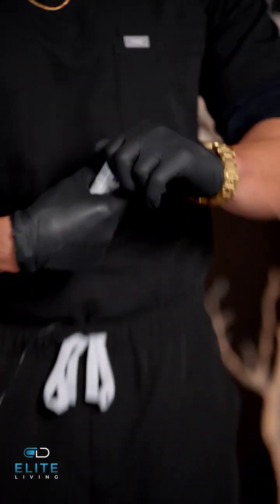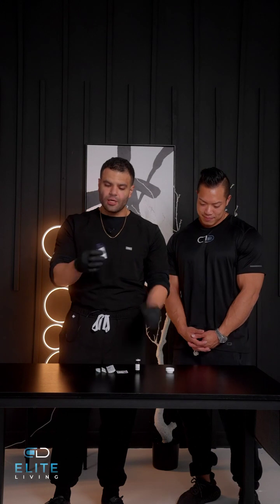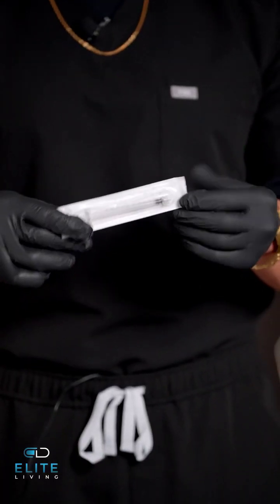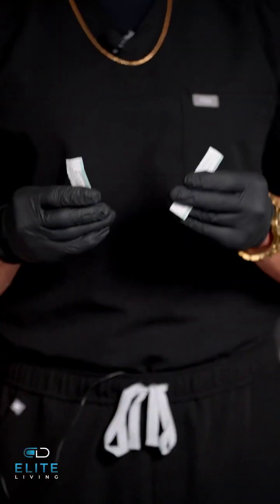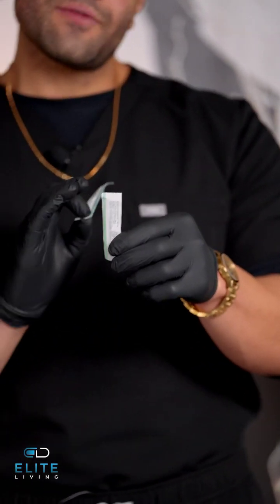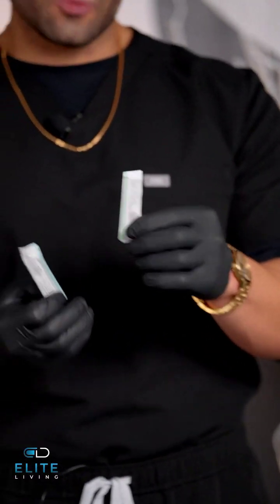To start, we have here our medication vial — inside will be the actual medication. We keep it in this bottle to protect it from any sunlight damage that could occur. We also have an alcohol pad for sanitation. Here we have a one cc syringe needle which we will be putting the medication in, and we have two different gauges, two different needles. The first one is a 21 gauge — this is what you're going to first have connected to the syringe to actually draw the medication.